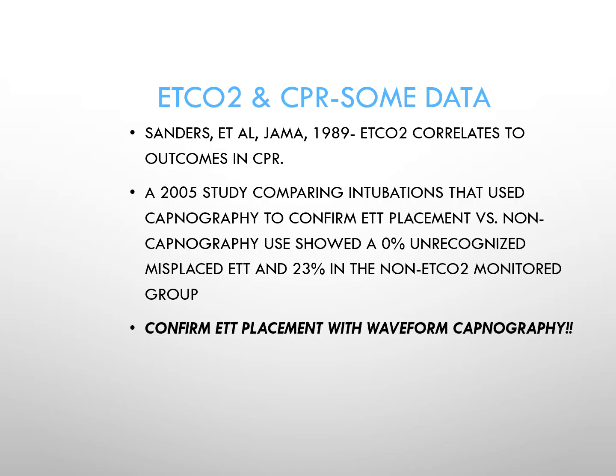A 2005 study compared intubations that used capnography to confirm ET tube placement versus other methods, and it showed 0% unrecognized misplaced ET tubes versus 23% unrecognized misplaced ET tubes when capnography was not used. So the moral of the story with this slide is to confirm ET tube placement with waveform capnography.